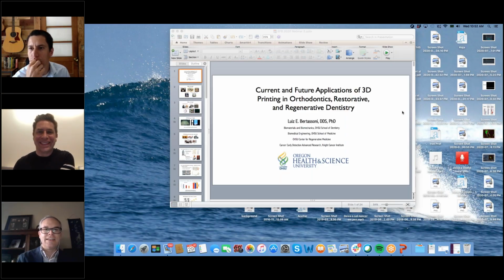Sure, thanks, Dan. The materials that we used in the studies that I presented were all commercially available resins from the manufacturer of the 3D printer. The exact composition is proprietary and isn't disclosed, but it's very similar to some of the materials that Luis was discussing early in his talk. It's a mix of methacrylated oligomers primarily.